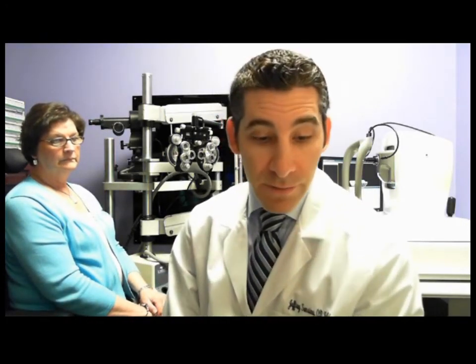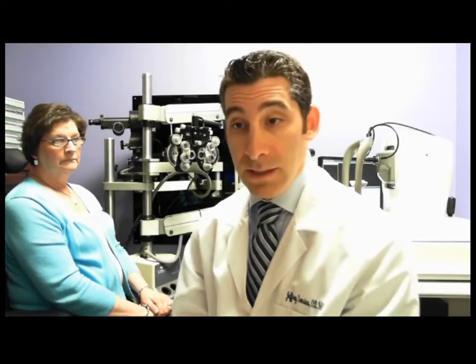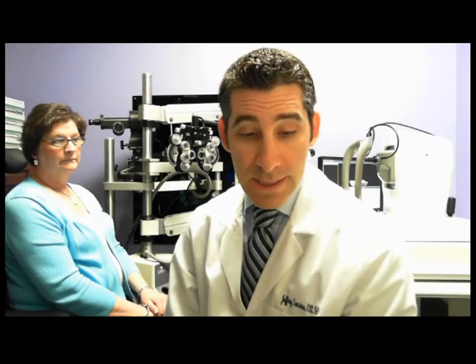To give you some background on some of her numbers, her refraction is +8.25 -7.00 axis 5 in the right eye, and that gives 20/30 best corrected vision. And in the left eye, she has +5.00 -3.00 axis 45, which gives a best corrected acuity of 20/60. So this is our starting point. This is the goal that we want to meet or exceed with the scleral lenses.